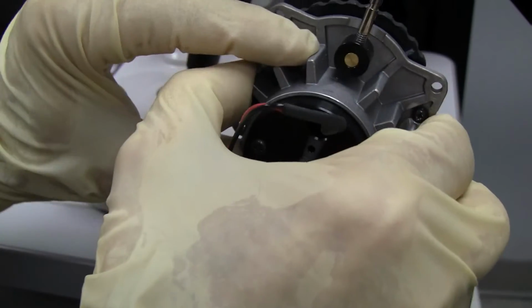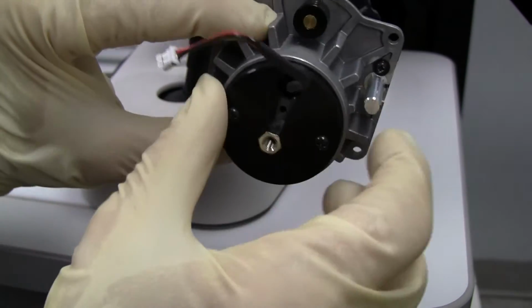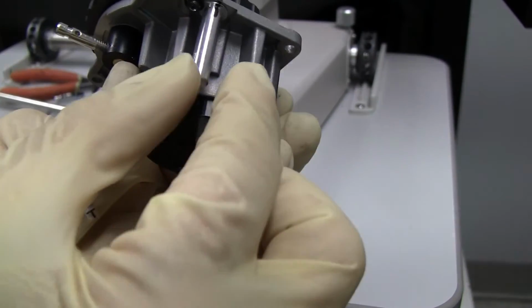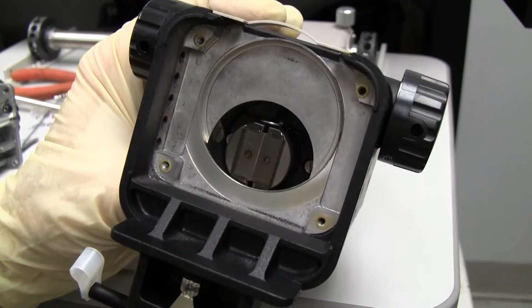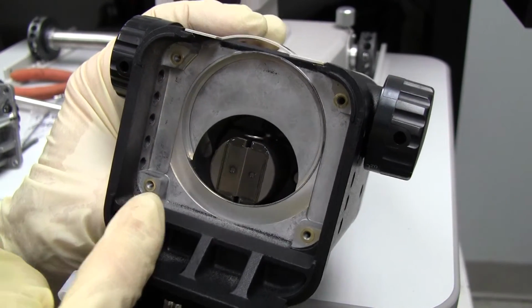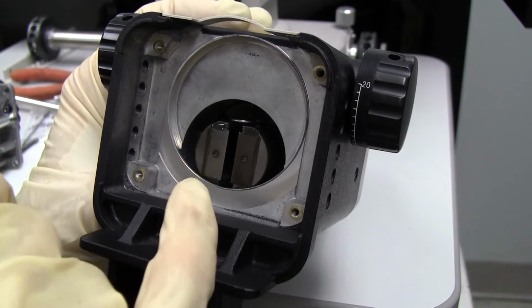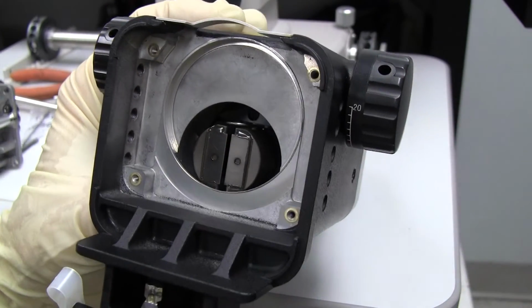And I will put it back in with the 4 screws and the cover. And later on, if you're going to have to adjust the diaphragm a little bit, remember you can loosen that screw and turn this little cam to adjust the diaphragm. If that's before you put it back in, make sure your brass washers are in place. That spacing is important, so make sure they're in there. And if your slits weren't clean, you might want to clean those real quick too while you're here.